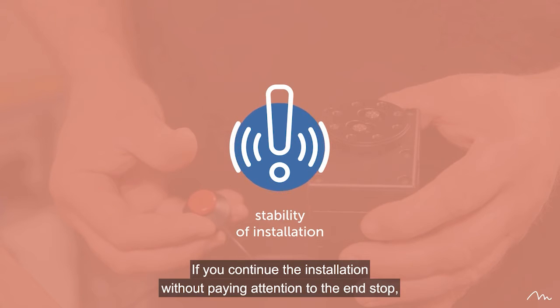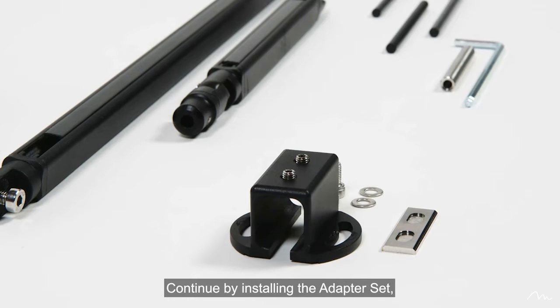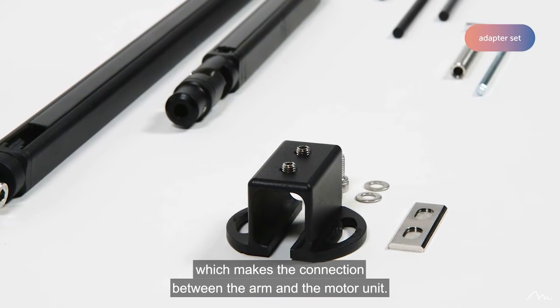Please note that this is a very important step, as the arm is most stable at its end stop. If you continue the installation without paying attention to the end stop, the result of your installation will be less stable. Continue by installing the adapter set, which makes the connection between the arm and the motor unit.